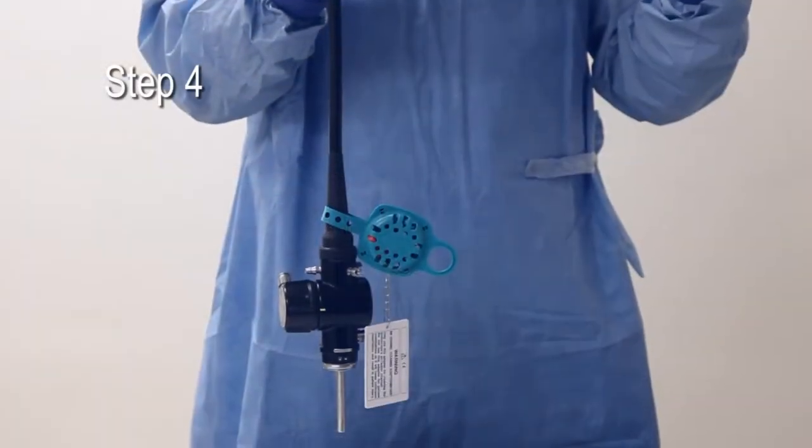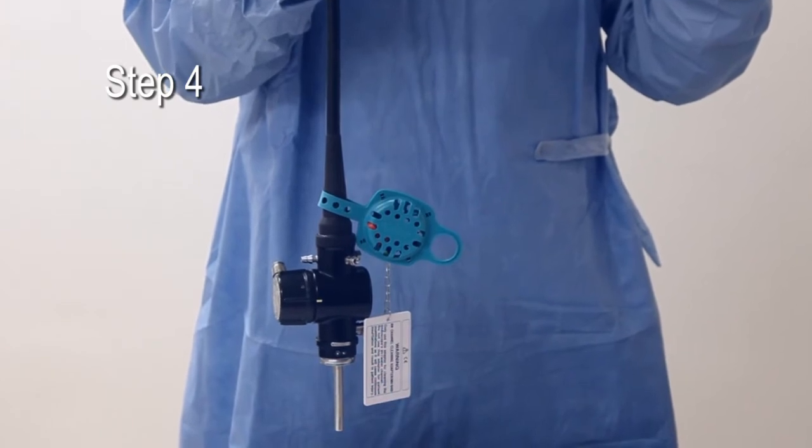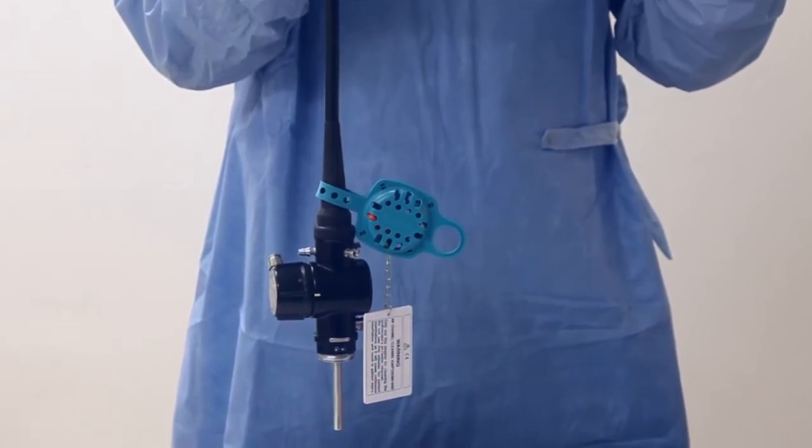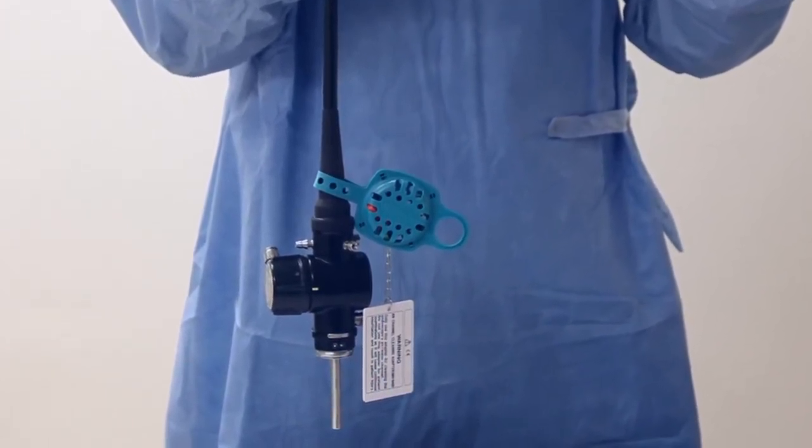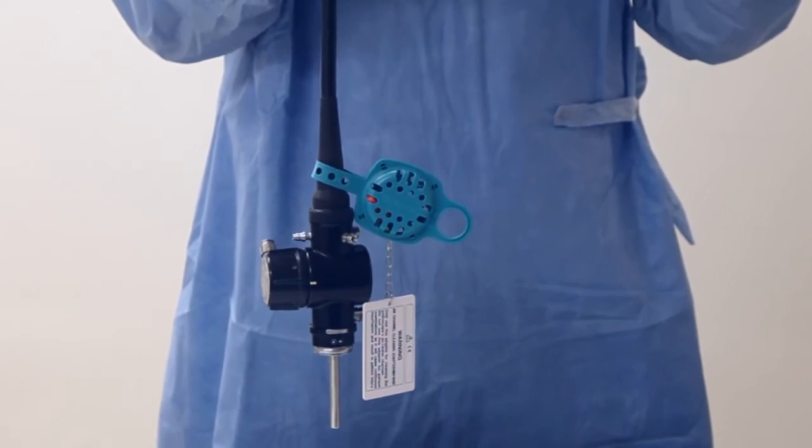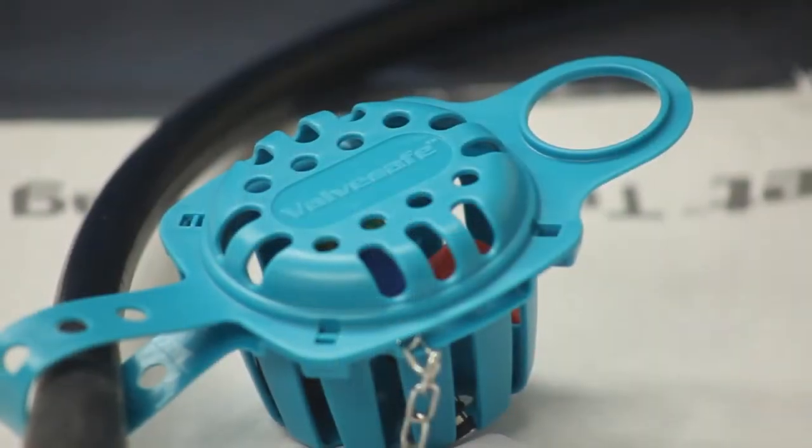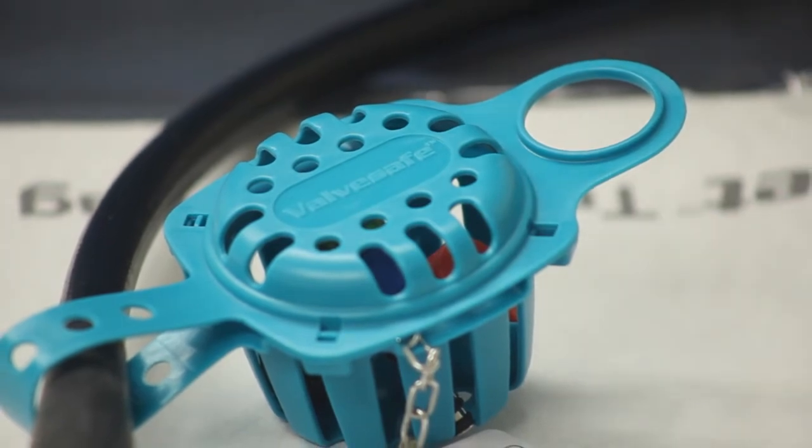Reprocess the scope and place it in a drying cabinet if necessary. It should be noted that the ValveSafe and the valves now stay with the endoscope as a unique set through the remainder of the decontamination process. ValveSafe also protects the valves through the decontamination cycle.